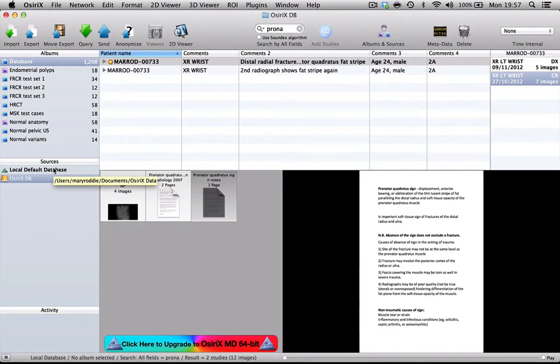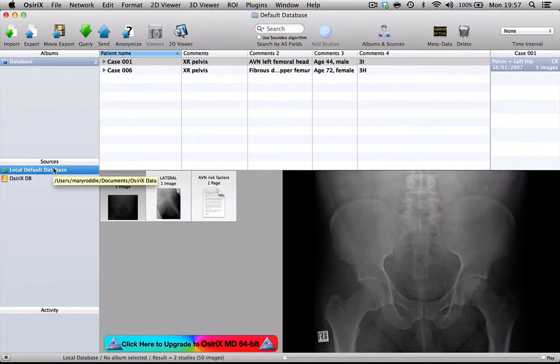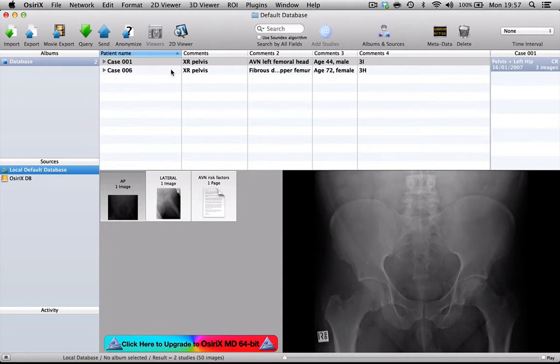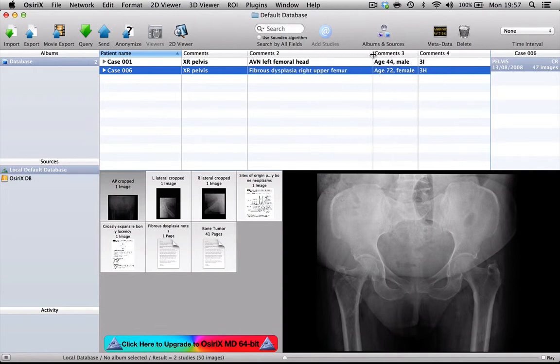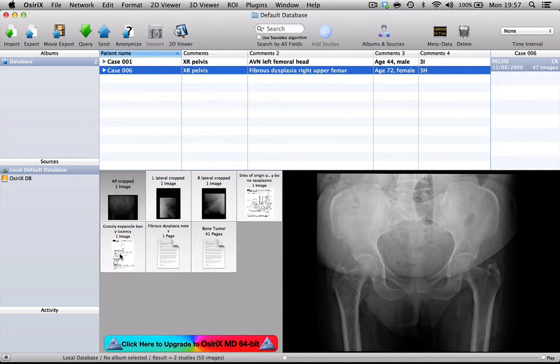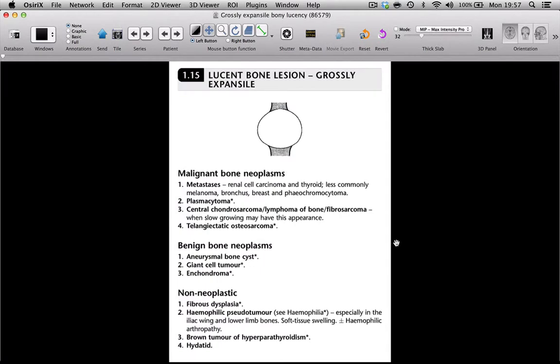Now finally, I just want to show you, with some other cases, just the sort of thing that you can put into each case. Here's an example of fibrous dysplasia. And you can see that we've been able to put in some nice diagrams from books talking about expansile bone lesions.